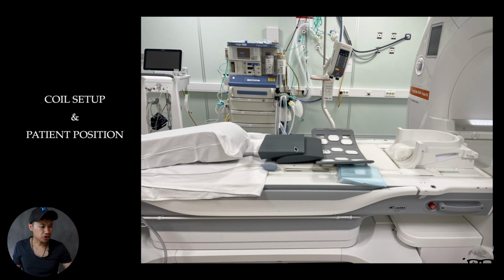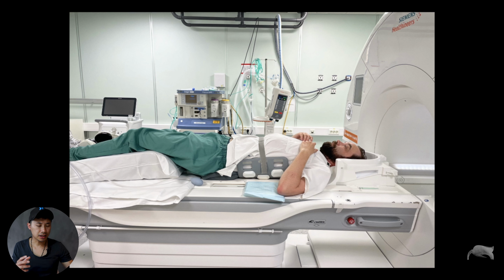And I'm trying to use some cushion just to lie a little bit more comfortable. You can see the setup is not 100% very comfortable. But the reason for this is that I'm going to eliminate the spine coil. I'm not going to use the spine coil. I'm going to use the Ultraflex 18. You can see my colleague is lying right here. So I'm trying to use a strap just to position the coil behind his back at kidney level.